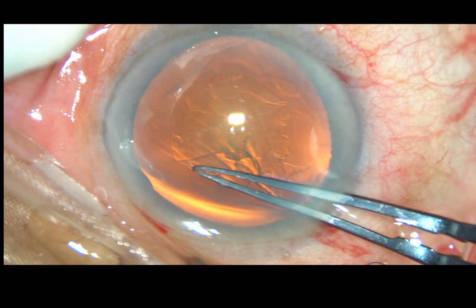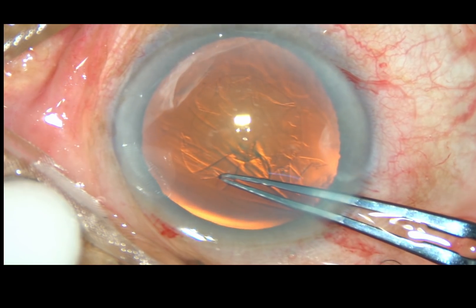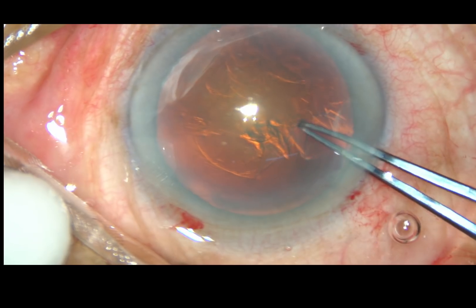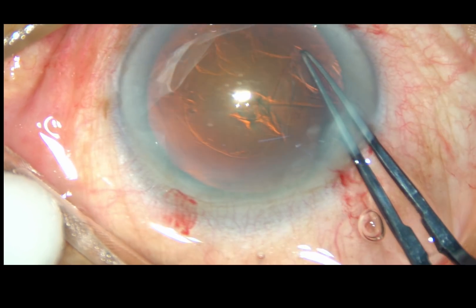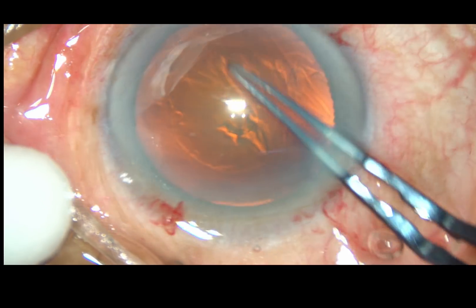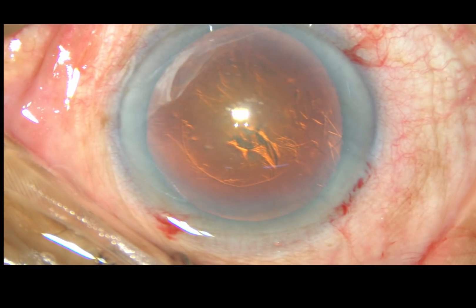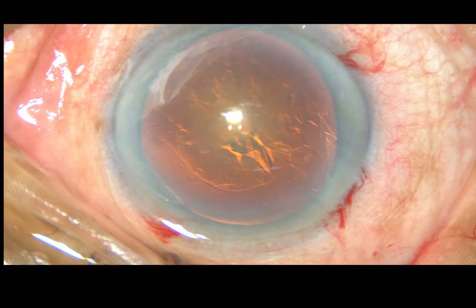Since if I go more peripherally, I will tear off more zonular fibers. I did a small rhexis, about 4 mm in size. Rhexis is done.